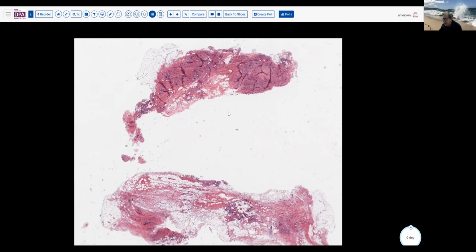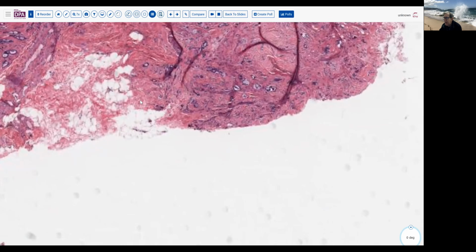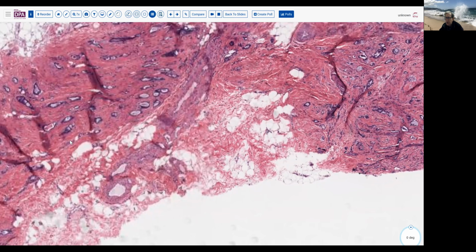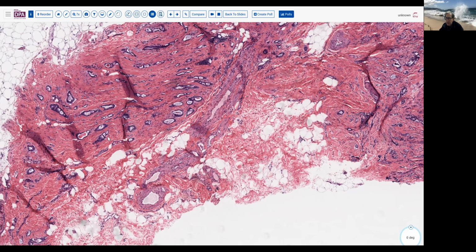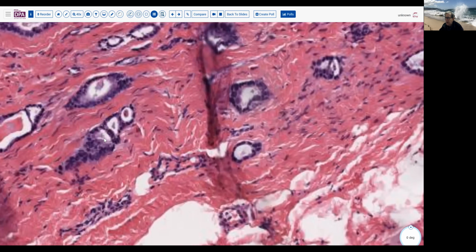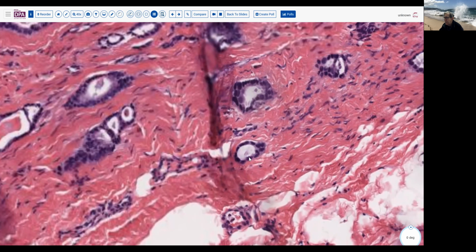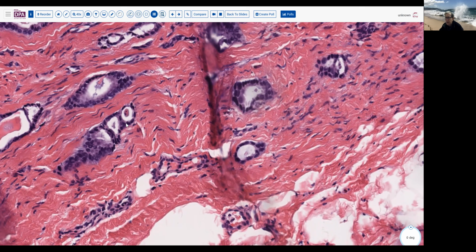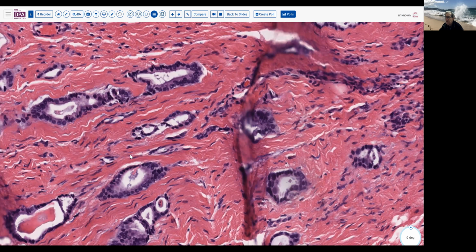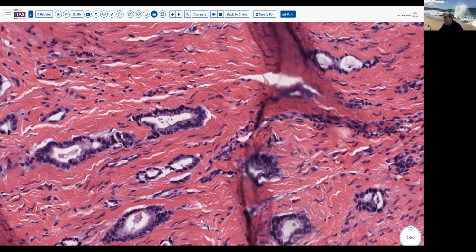So here's a case that is touted as being tubular carcinoma. You'll see the majority of these groups are small tubules, small ductal spaces. And as we look at these on higher magnification, very small cells, generally small nuclei. And let's see if we can find any nice snouts in this case to illustrate that feature for you.